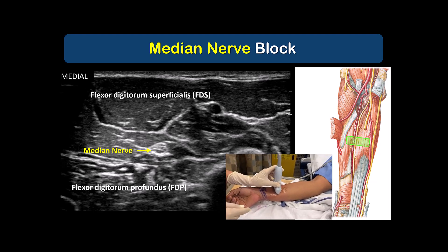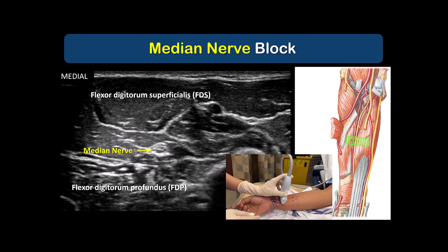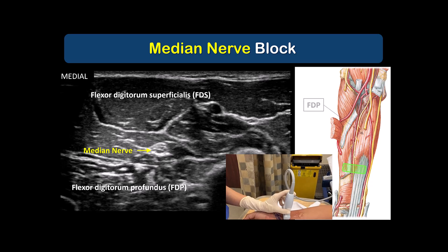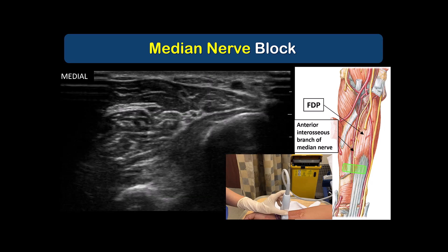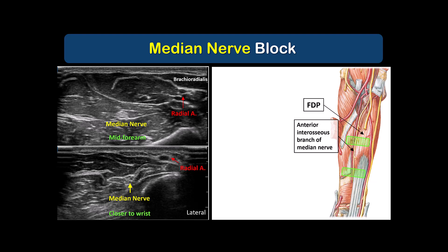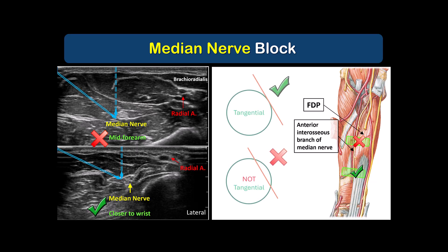For a motor-sparing block of the hand, we do not want to block the median nerve up in the forearm. Instead, trace it into the distal forearm towards the wrist, where the muscles thin out into their tendons. We will then be distal to where the median nerve and its anterior interosseous branch are innervating the muscle bellies of the flexor digitorum muscles. We do not want to block the median nerve in the mid-forearm. Instead, we want to block it close to the wrist. The nerve may be blocked using an in-plane or out-of-plane approach, but always advancing the needle tip at a trajectory that is tangential to the nerve surface to avoid piercing and damaging it.